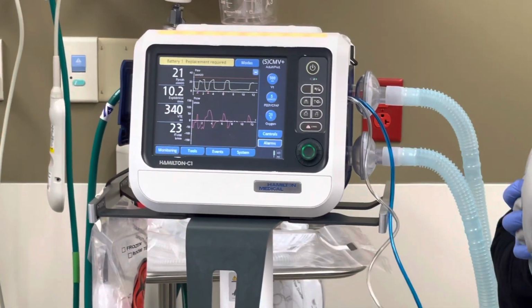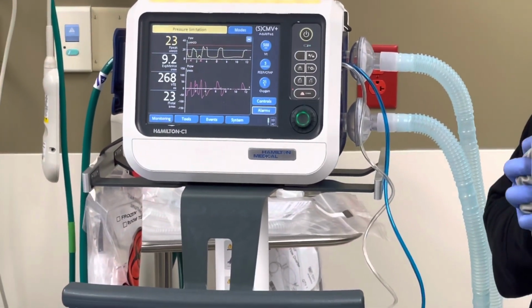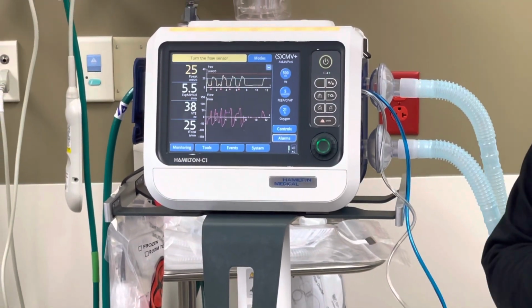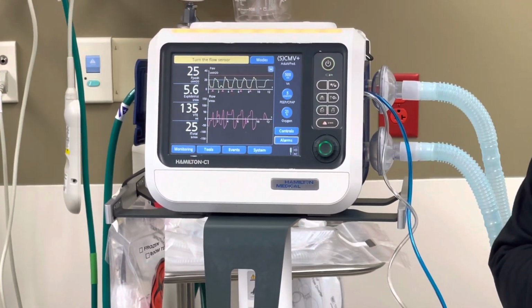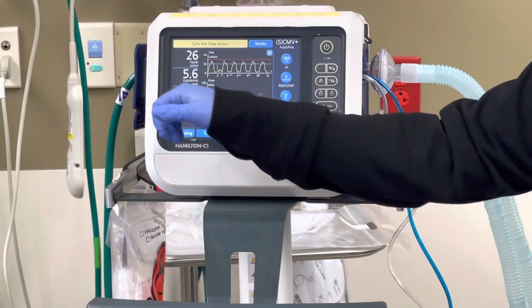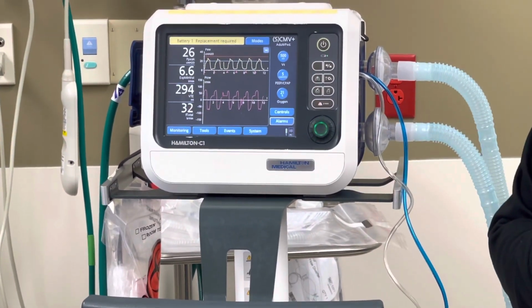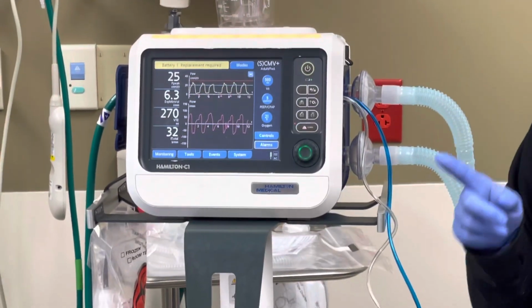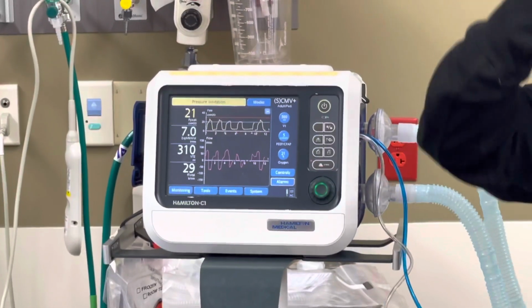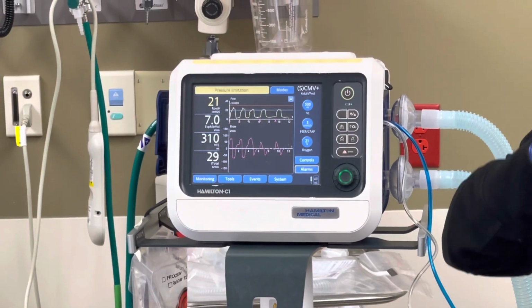So when I start to hit my pressure limit, it's going to tell you. Basically what that's telling me is that I'm hitting my pressure and it can't go any further. So it's not able to deliver my breath because my volumes are going to get lower too. One of two things could be happening there. It's either going to be a lung issue or your alarms are set too close to the patient and they're not able to breathe.